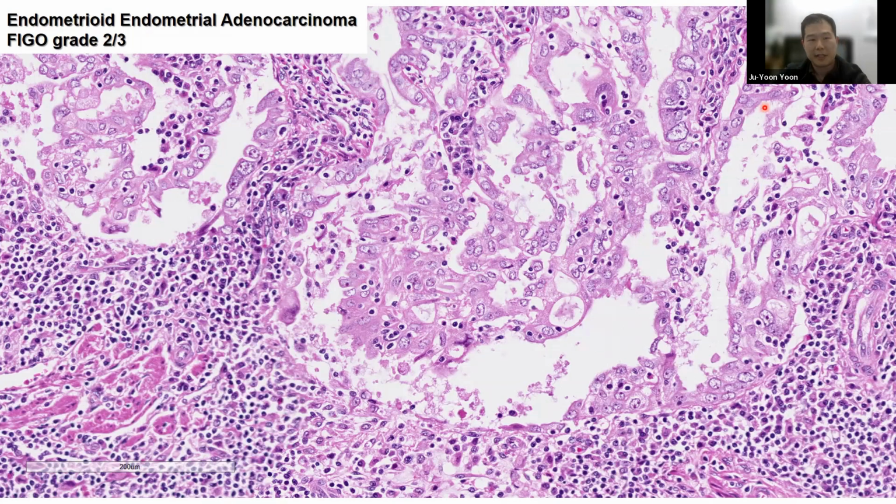Even though a lot of it is gland forming, the cytologic atypia exceeds what I usually see in grade 1. So grade 2 is how I end up grading it because of that. But also note that even though this is very highly atypical, there's a lot of quite eosinophilic cytoplasm. These are some of the histological correlates that we can see in this, not a separate entity, but this particular form of endometrial carcinoma.